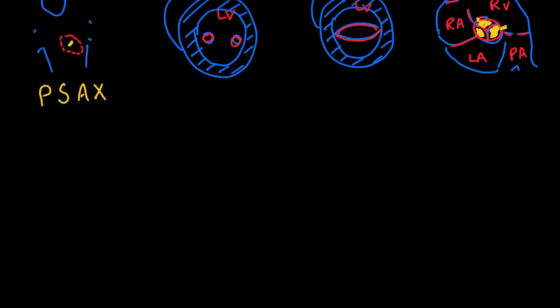Let's look at another view. So again, here's our patient's head. Here's their torso with arms, and their heart sits right here.